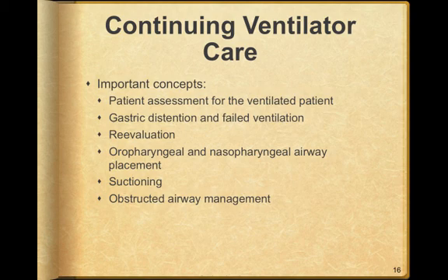Suctioning. Whenever we suction, be sure that the suction unit is ready. The purpose of suctioning is to minimize the risk of aspiration and to prevent it, if possible. Rigid Yankauer or tonsil tip suction devices should be utilized with the suction unit and inserted into the oral cavity.